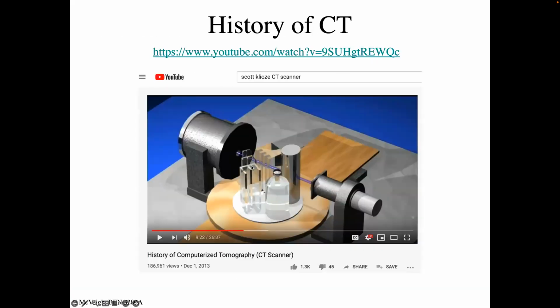And instead of changing the angle, this was on a rotating table, and he just clicked the angle and then scanned again, and then clicked the angle and scanned again, right? So instead of rotating all this gizmo, he rotated the sample around to get all of the projections through the sample. You could do that with people, right? You could put them on a stand and rotate them and image them with a chest X-ray machine, and you could make a CT that way, but they'd probably move around a little bit. They'd get dizzy. They wouldn't like it.